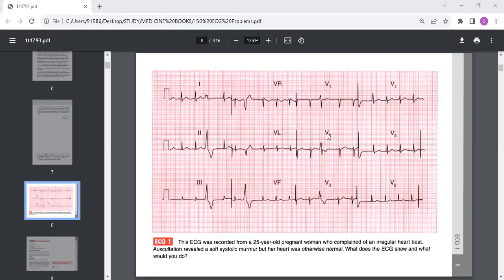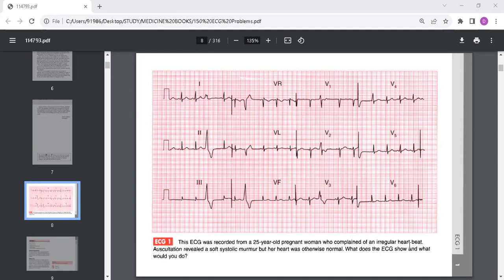Here you have an ECG recorded from a 25-year-old pregnant woman who complained of irregular heartbeat. On auscultation a prevailed soft systolic murmur but the heart was otherwise normal. What does the ECG show and what would you do? If you examine this ECG it shows sinus rhythm since each beat is being started by the SA node.